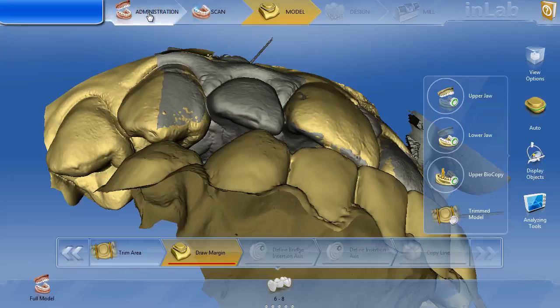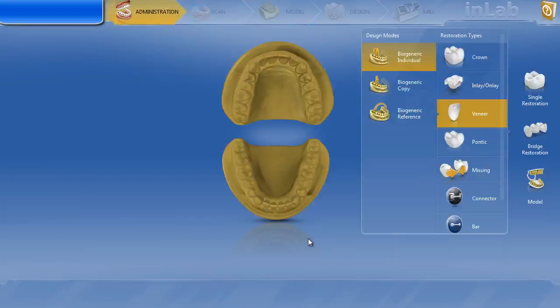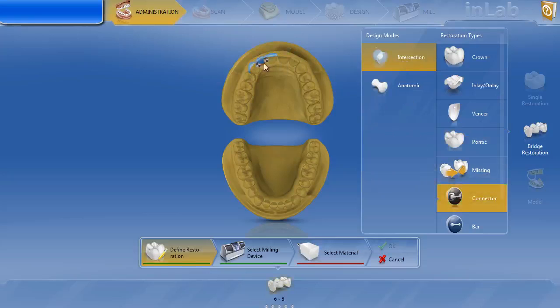Let's go to administration. We're going to delete the restoration altogether. We'll do bridge — veneer, biogeneric individual, tooth number eight; pontic, biogeneric individual, tooth number seven. I'm just going to start out with intersection connectors. Our material — it could be any material, but let's say we want to do Emax. We'll hit OK and go back to the model.